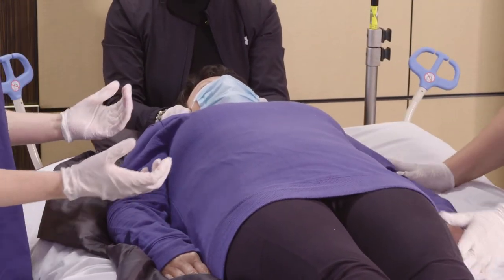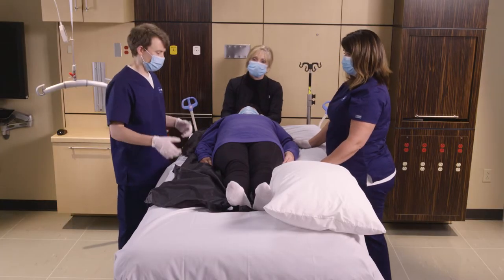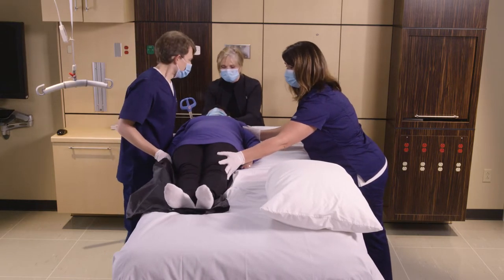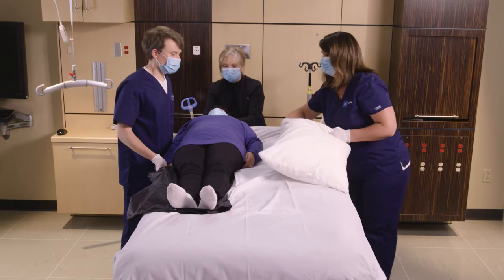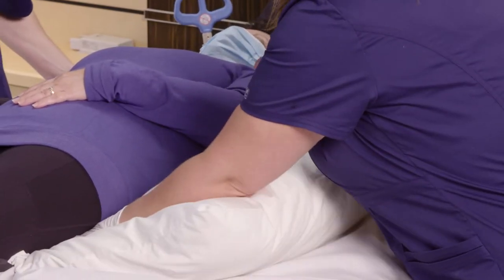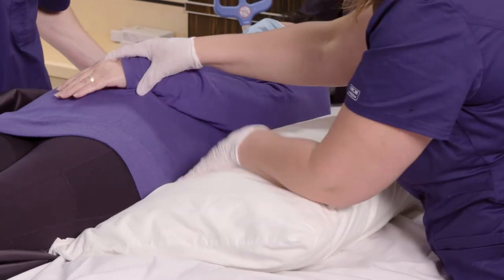First, we're going to bring the patient opposite the side she'll be turning to, to the edge of the bed. Then we're going to tuck a pillow on the side towards which she'll be turning, and then tuck her hand under her body.